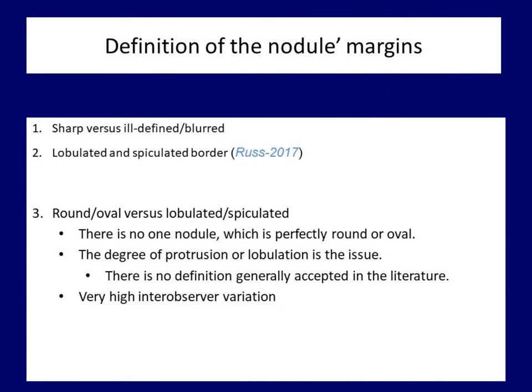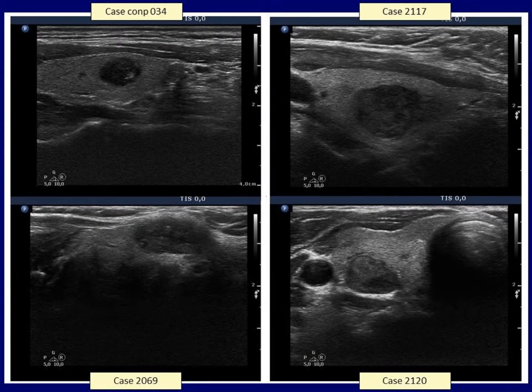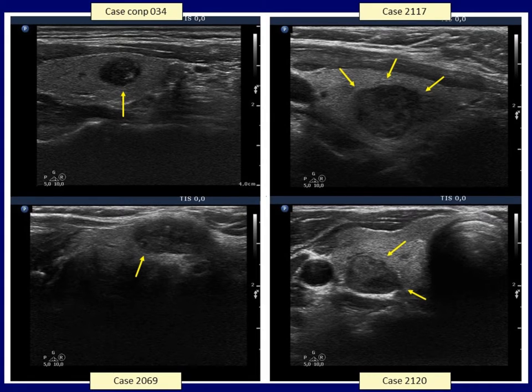The main issue of irregular borders is the inter-observer variation, which is the highest among suspicious ultrasound characteristics. This is explained by the lack of perfect geometrical nodules and by the lack of a uniform, as exact as possible definition on irregular borders. I emphasize again the superiority of real-time analysis over still images. Except for the left upper case, all nodules prove to be benign. All four lesions present irregularities of the margins. The issue is whether the degree of the protrusions reaches the pathological extent or not. Analysis of real-time video is the cornerstone in the judgment of nodule borders.